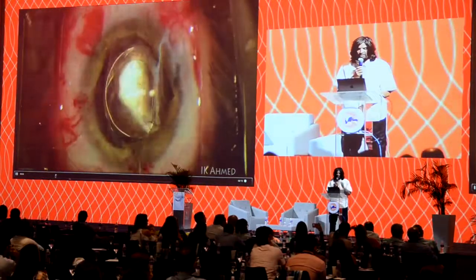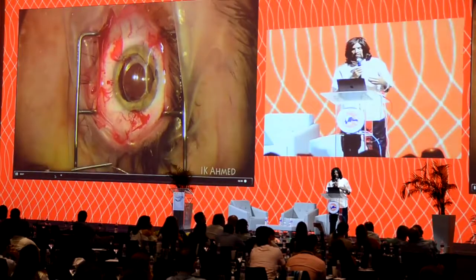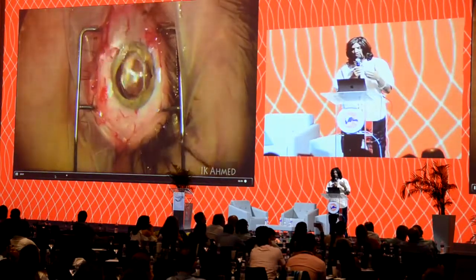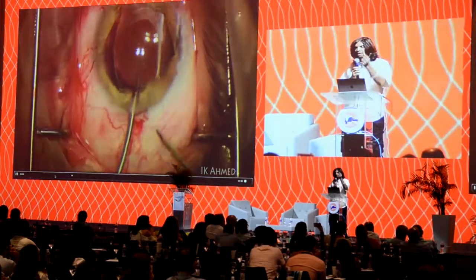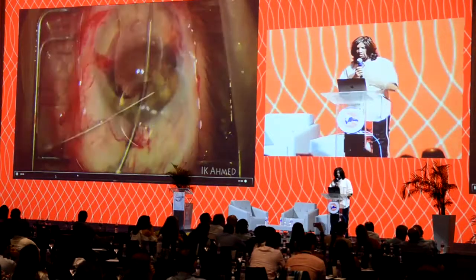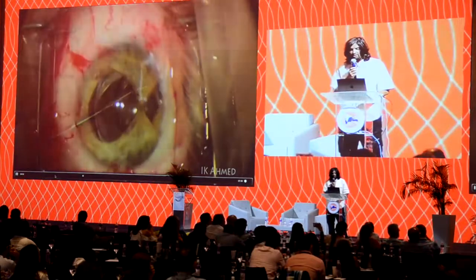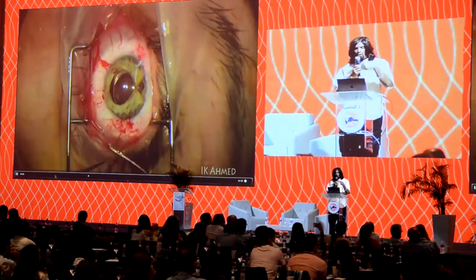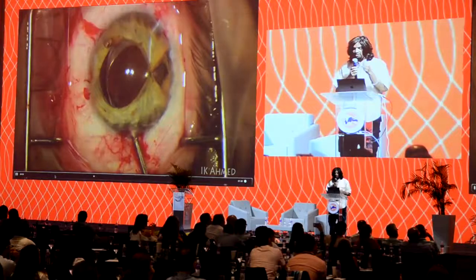Now here you see, again, our Ahmed approach. Bring the Kuglen out of the eye, loop around the micro tyer, grab the short end. You can square the knot here, and then slide the knot into the eye to cinch it down, and watch the iris come together, controlled. One forceps outside the eye. And we do a slow pull here, and now we can bring the short end out of the eye again, lock the suture with a micro tyer, and then slide in again.